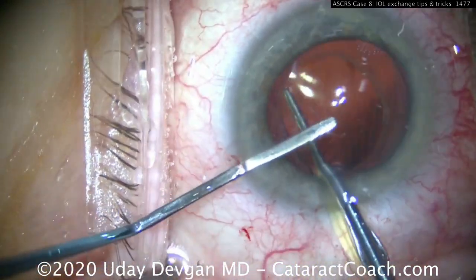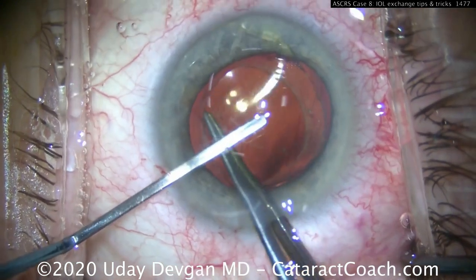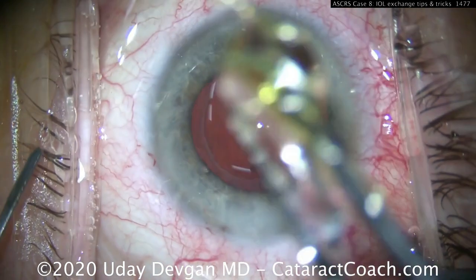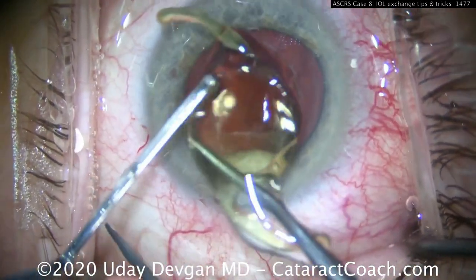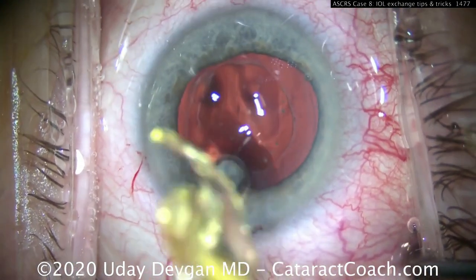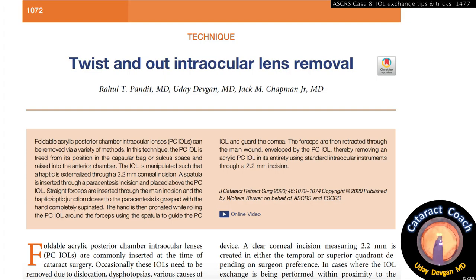A spatula goes into the eye; the anterior chamber is full of viscoelastic. We're going to twist this lens using the spatula to help twist it and also protect the endothelium, then pull it right outside the eye. Just like that — that simple. That's the twist-and-out technique.